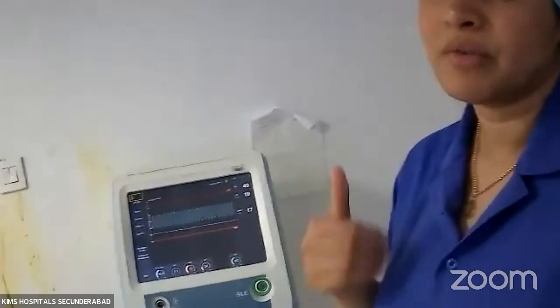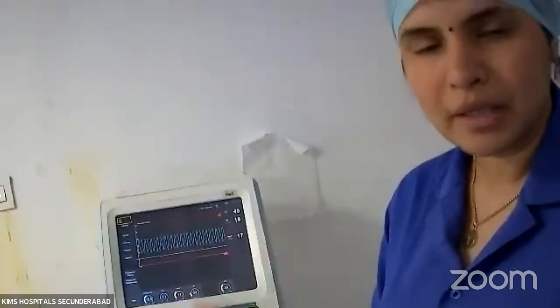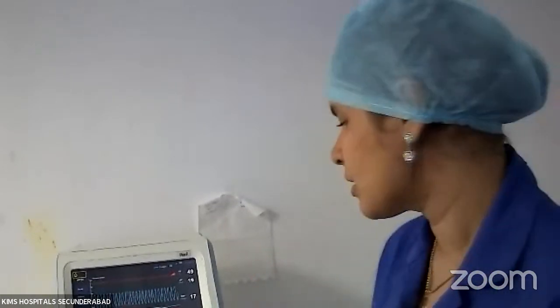Lesser the wiggles, we may have to increase the delta P. While doing this, also try to rule out other causes like endotracheal tube block, poor wiggles because of chest wall rigidity, or using a very small ET tube or an ET tube with a long length or an uncut endotracheal tube, which can contribute to dead space. Despite all these measures, a baby with poor lung compliance will have less chest wiggles.